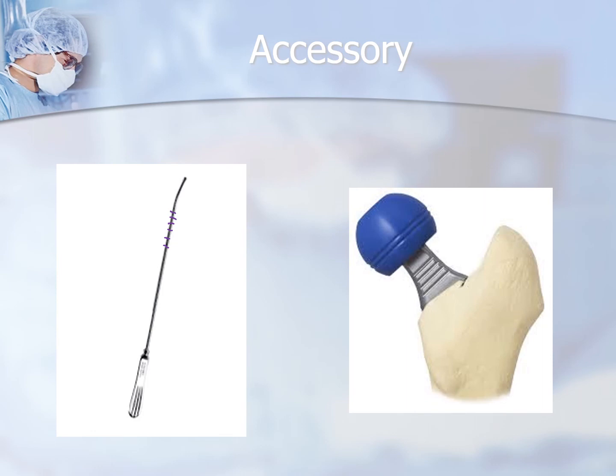And then over here on this other side is a representation of orthopedic trials, or sizers, if you will. So anytime we do any joint replacement or anything like that, before we open up the real deal, because that is really costly, inside our trays are these pretend implants called trial implants. And so the surgeon is going to want to trial the sizes that he or she wants to make sure that they are appropriate before we open the real implants.